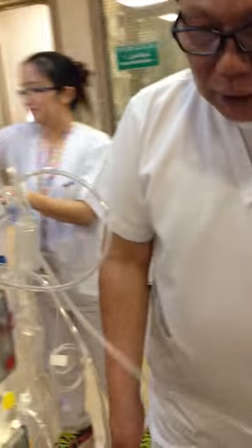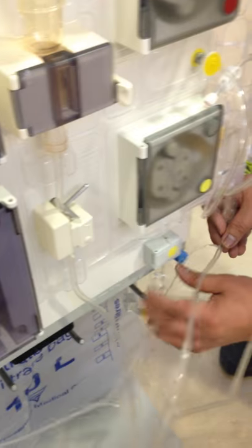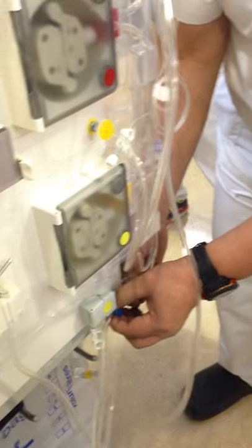Another very important thing for us to remember is this should always be under. Remember, you always have an alarm which you call the balancing error, because if this one is touching, it creates a weight. So put this under. I'll put this over the other side. I'm going to distribute to everyone.